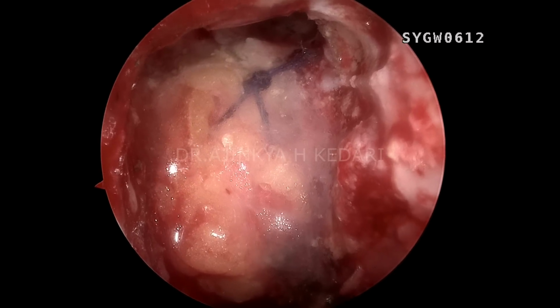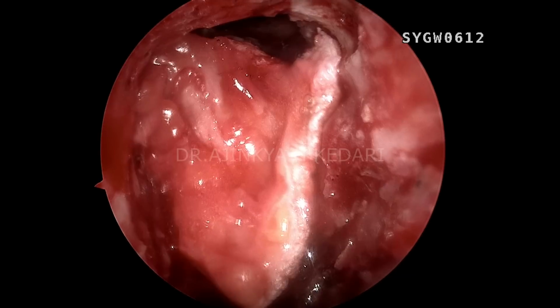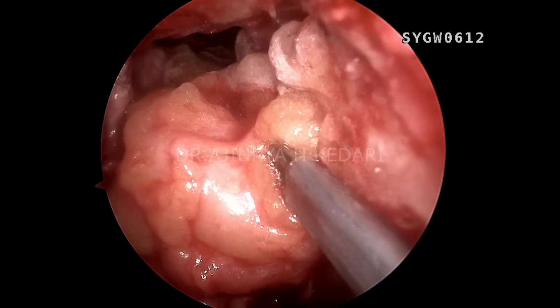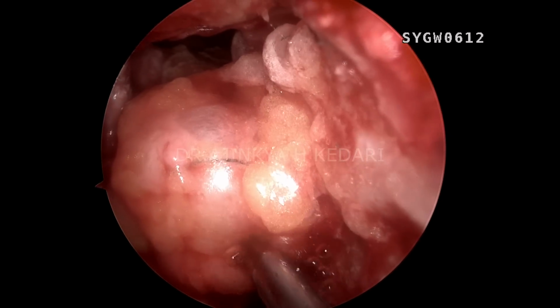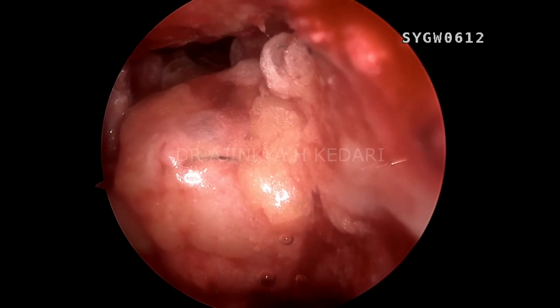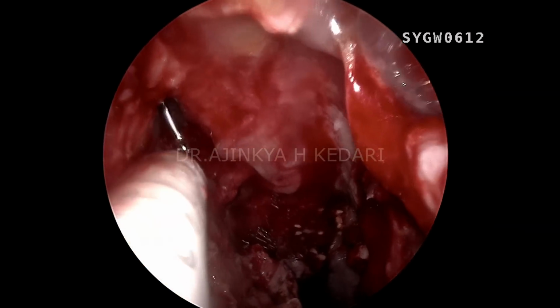Make sure when you put the glue inside, the frontal sinus should be patent enough, as otherwise it will cause a secondary mucocele. You can see one more fat plug over this and one more tissue glue layer, and you can see at your 11 and 12 o'clock, that's the frontal sinus opening, quite patent. Make sure even when you put the free fascia graft, do not block the frontal sinus.